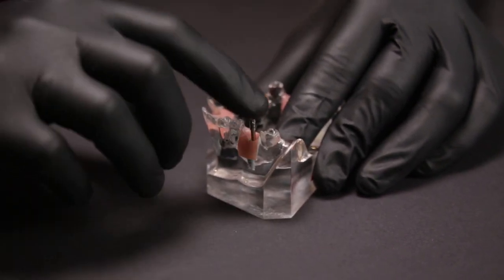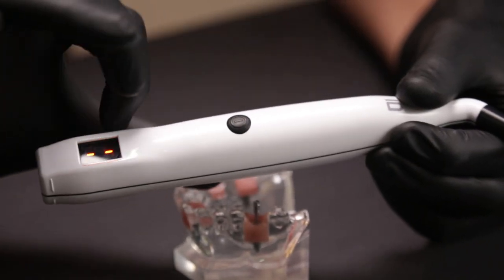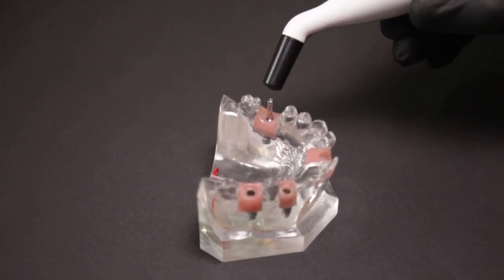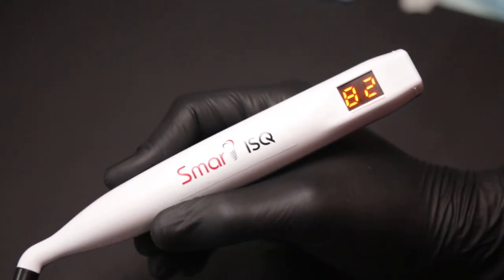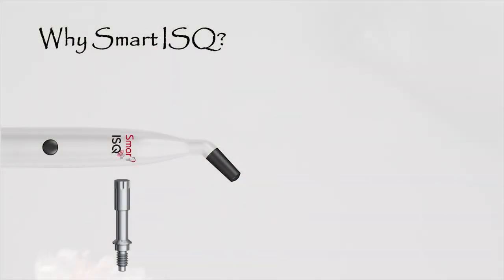I need to make sure it is tight enough, just snug in place. I then take the Smart ISQ device and push the black button to switch it on. I approach the multi peg from the coronal aspect and come close to it to get the reading. It's as simple as this — you can see I have a reading of 82 in this case, which tells me it's a good time to load the implant now.